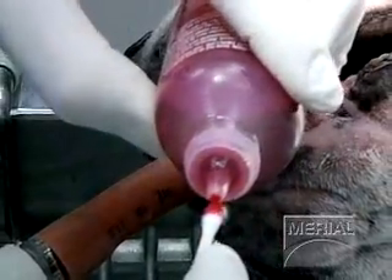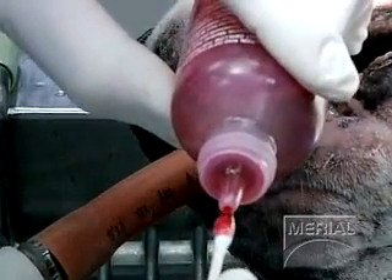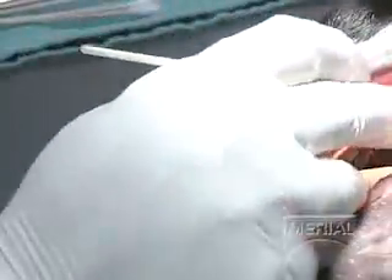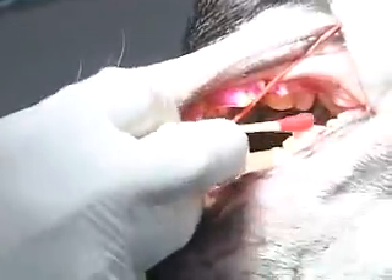This is the reveal solution — a disclosing solution — and this is to check and see if we have any plaque. You're going to see it taking up some stain, but we're going to rinse it with a light rinse. If anything is staying behind after rinsing, then that's an area we need to focus on a little bit more during our cleaning.